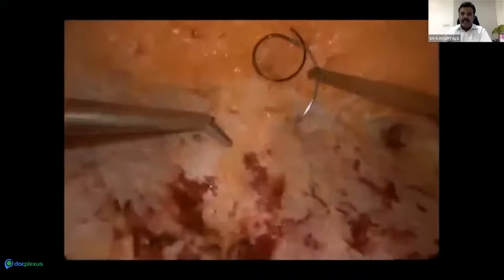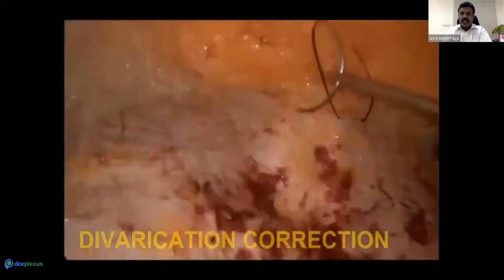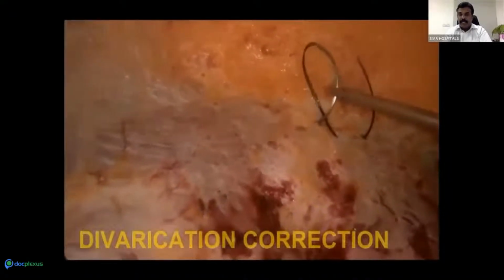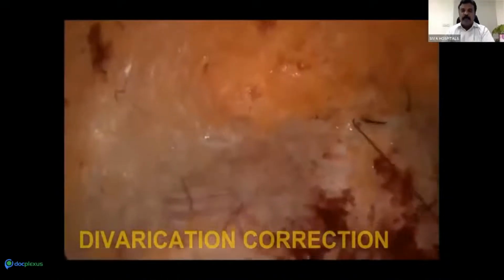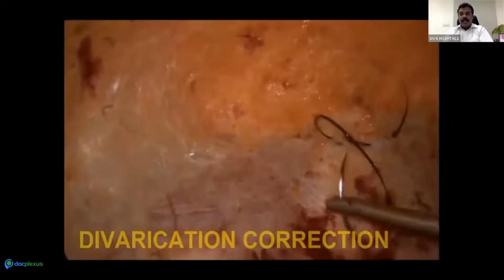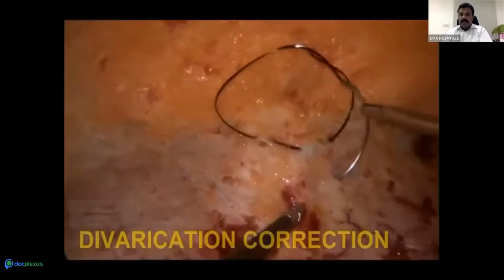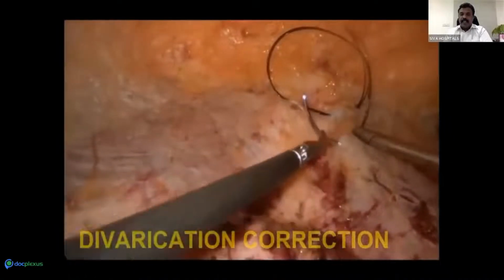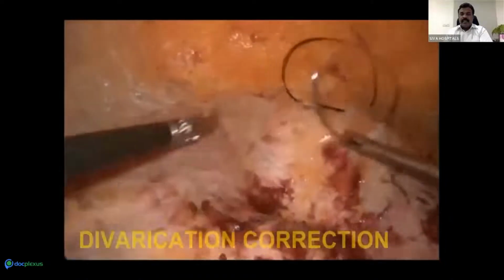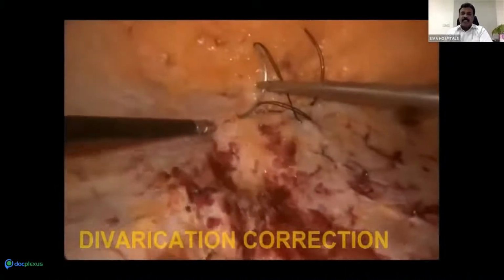Like you can see where I am showing, that's the xiphisternum. Up to the xiphisternum, around 15 to 17 centimeters, the dissection is carried out. Now I've just taken a 2 Ethilon, a loop Ethilon from outside, and just started suturing from up at the xiphisternum. Here I'm using a single suture, plicating the rectus muscle, rectus sheath to create the linea alba. It's an augmentation of the linea alba. So the suturing is a little bit hard because the needle is very big and you need a strong needle holder.